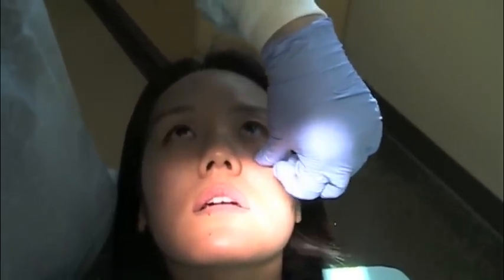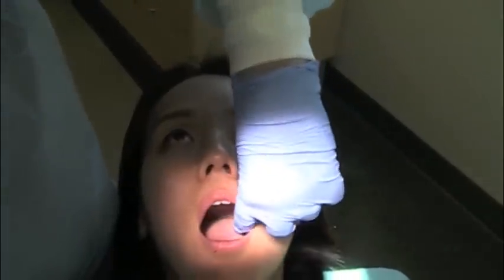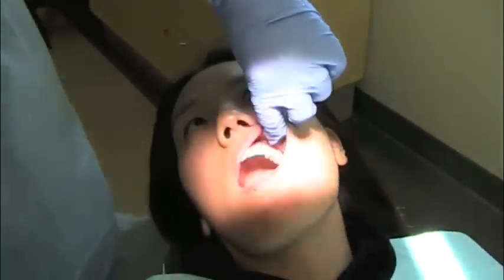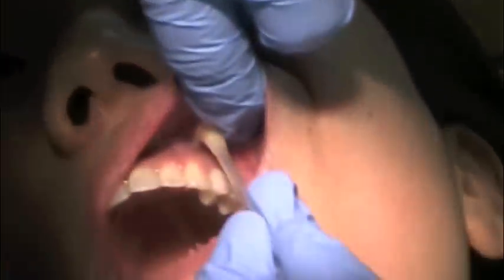First, ask the patient to look at the ceiling. Then, identify the infraorbital notch. The infraorbital notch is located just below the eyeball. Then retract the upper lip and apply the topical, just at the mucobuccal fold, right below the infraorbital notch.